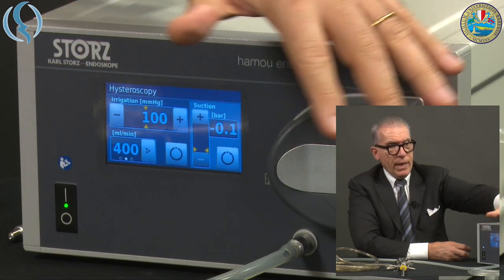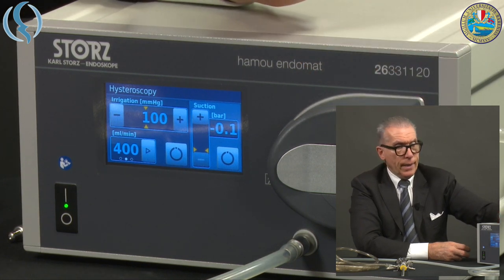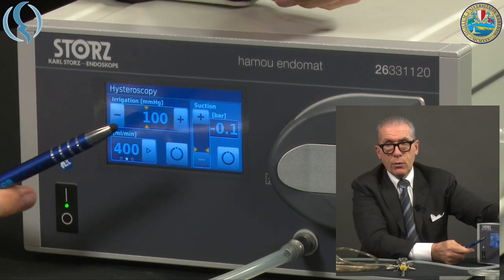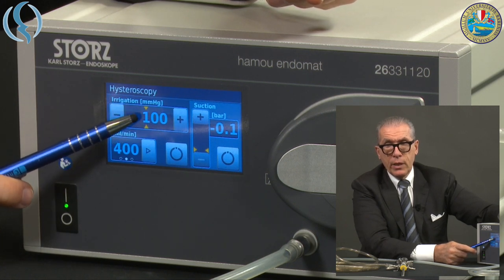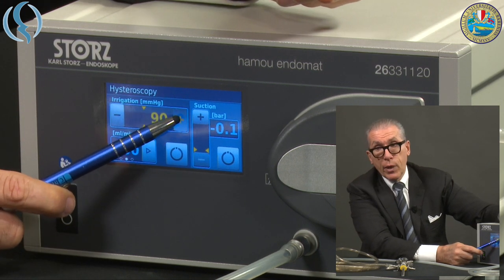The screen shows the irrigation, the suction, and the flow — as in the previous version. There are not many cables going around, so the connection is much easier. Regarding the parameters, you can regulate the default irrigation pressure using these two arrows to increase or decrease the pressure.